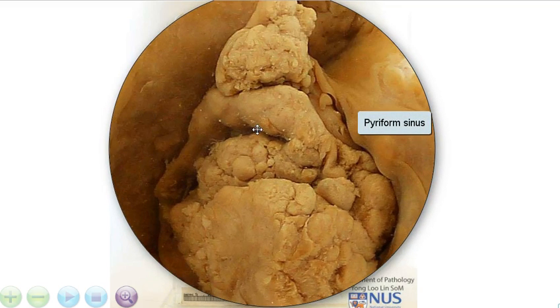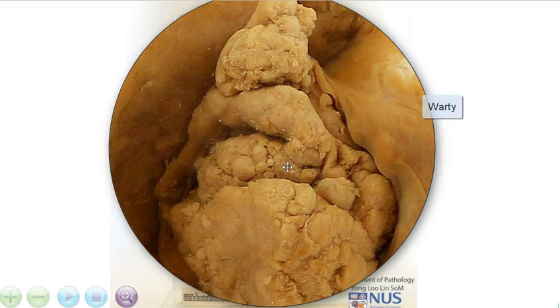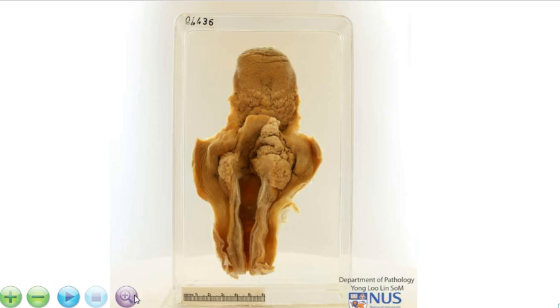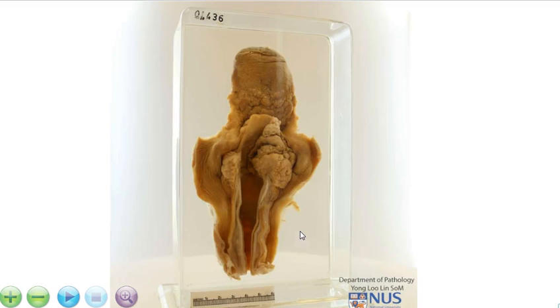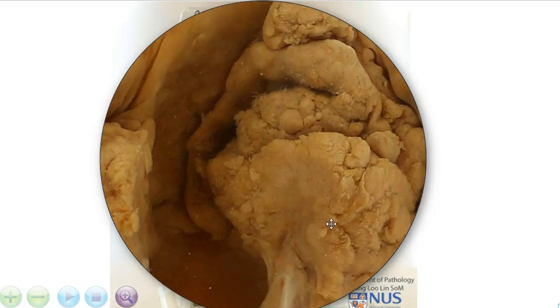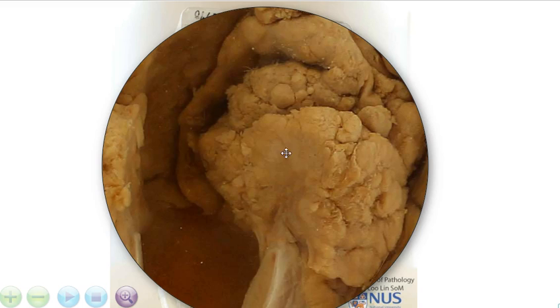This tumour has a slightly warty appearance, if you notice, and the cut surface is rather fleshy — just to show you a clearer view of the cut surface here.